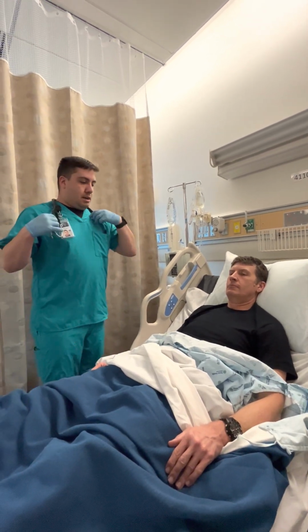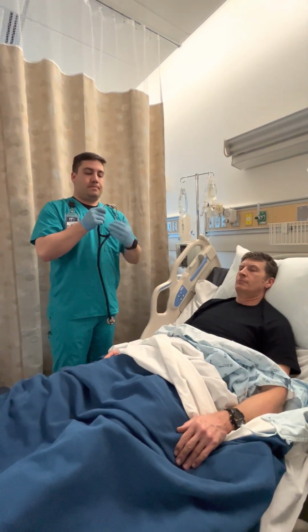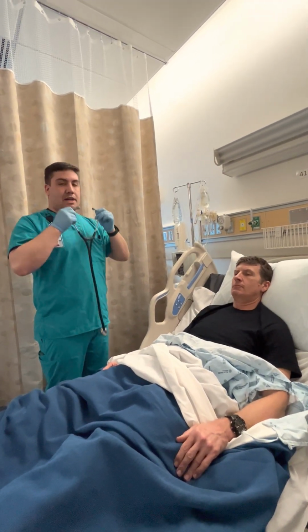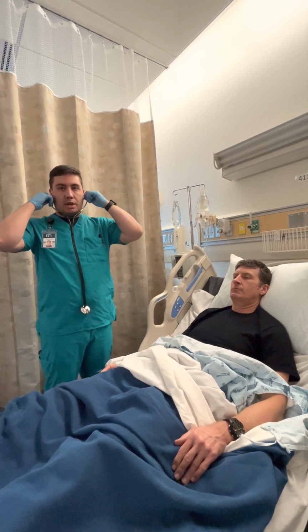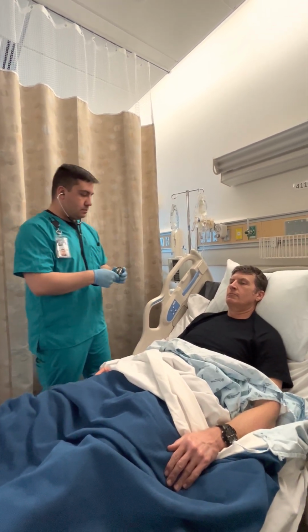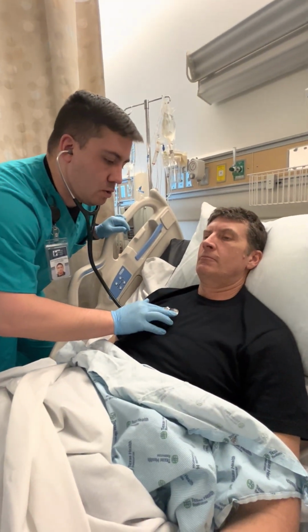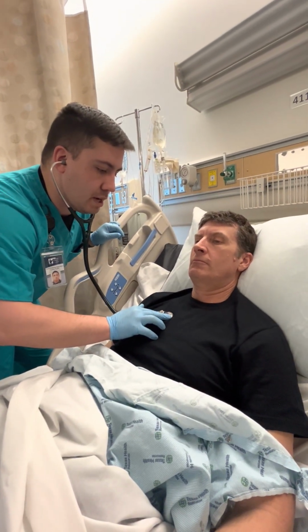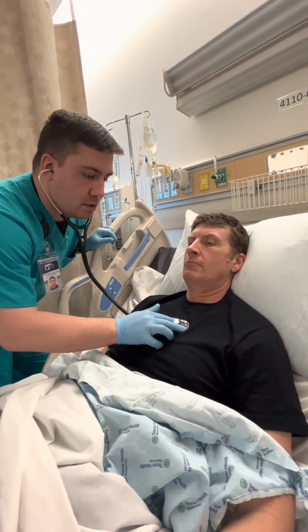Okay. I am now going to listen to my heart sounds. With Master Cardiology, I don't have a bell. I would just push in a little deeper to be able to hear S1 and S2 effectively. Okay, so we're going to start with our aortic area, a little bit to the right of the sternum. We're going to listen to our pulmonic area a little to the left of the sternum.